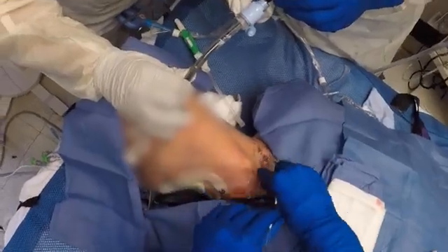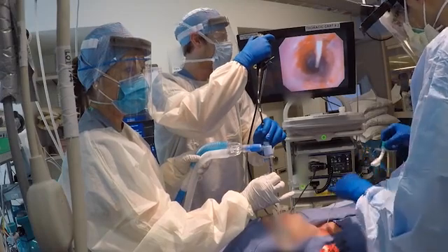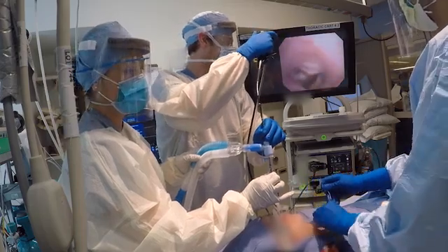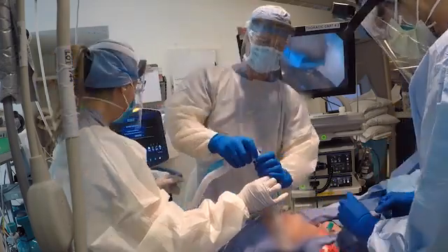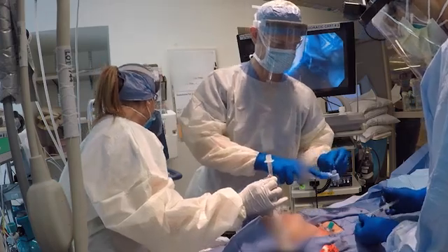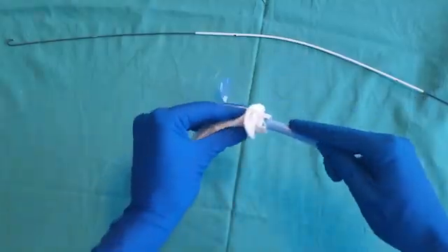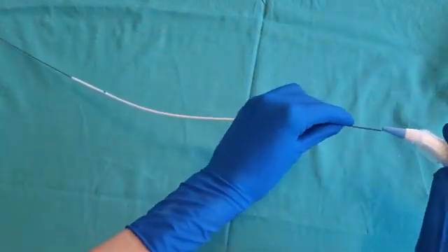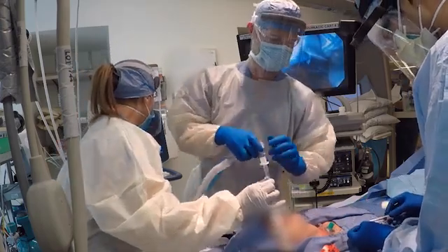Then insert an appropriately sized tracheostomy tube directly into the trachea over the wire and protective sheath. If using a flexible tracheostomy tube, insert the tube with the curve directed toward the patient's head. Once you visualize the tube in the patient's trachea, rotate the tube 180 degrees to its normal orientation; this prevents the tube from creating a pre-tracheal plane. Alternatively, a non-flexible tracheostomy tube can be loaded onto an insertion trocar and advanced over the wire and protective sheath into the trachea. Remove the protective sheath, wire, and trocar if used.